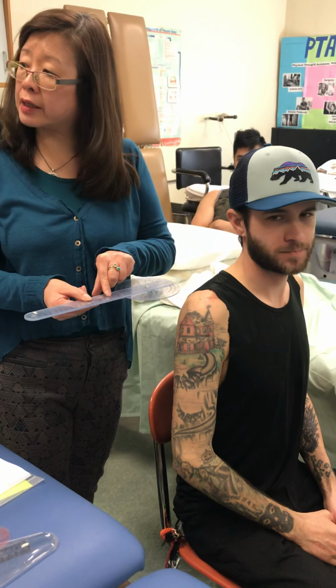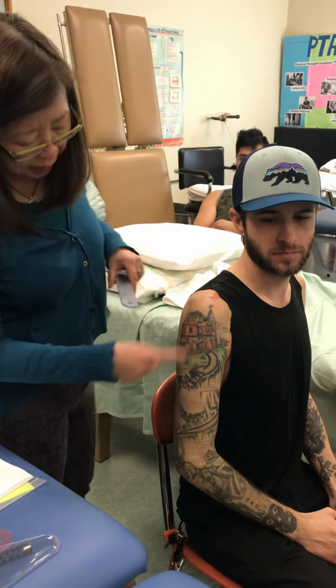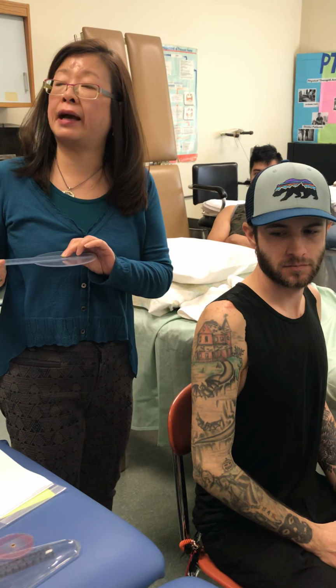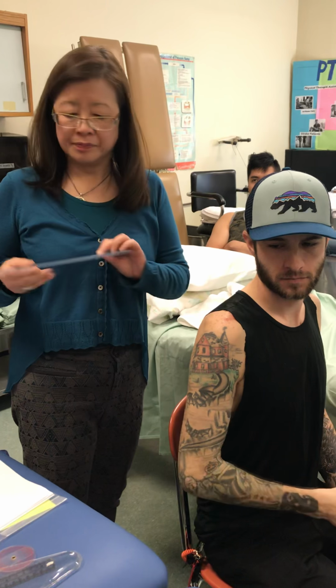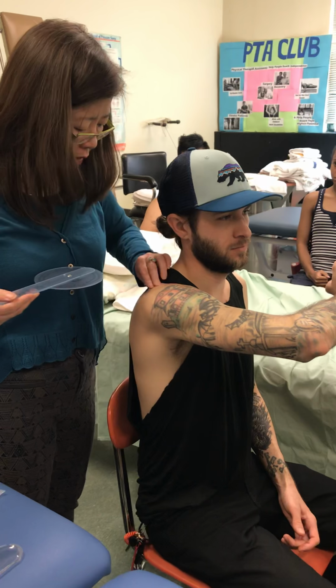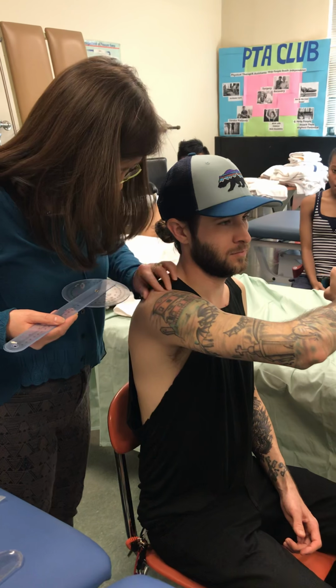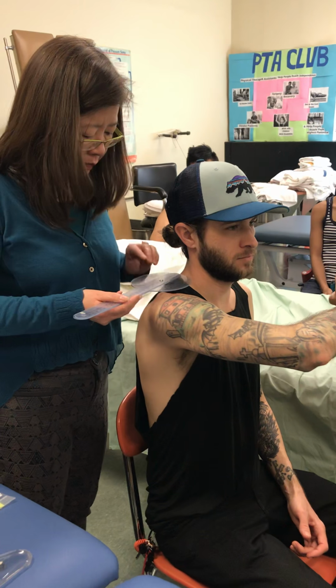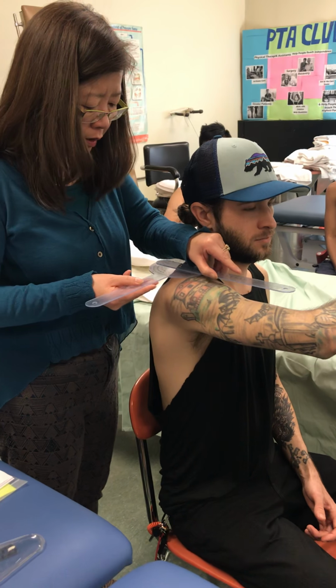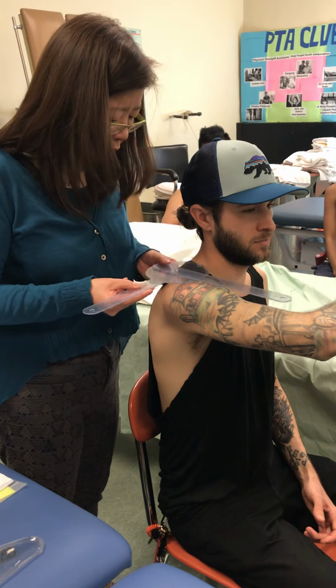The moving arm, or distal arm, lines up with the midline of the humerus, the axis right over the superior aspect. Can you keep your arm like that for me? Way to go. Okay, line everything up. Now, midline of the humerus.